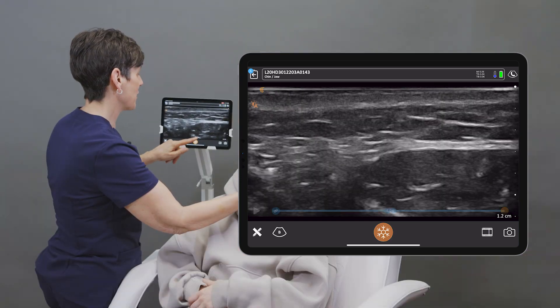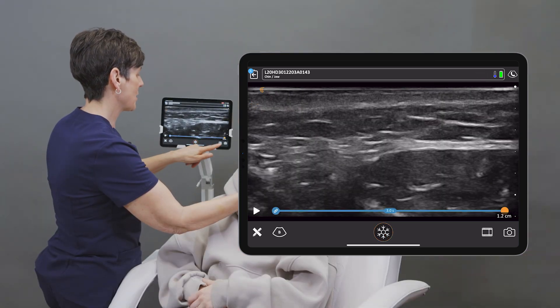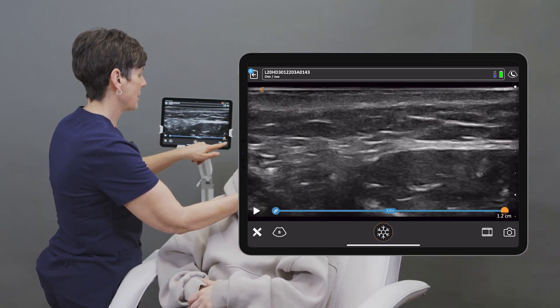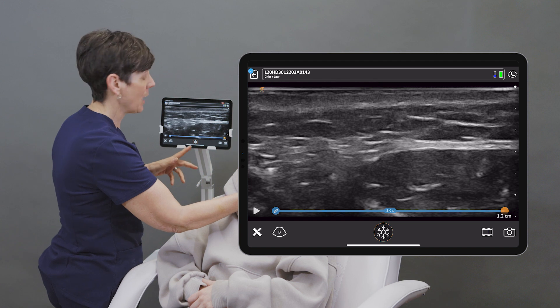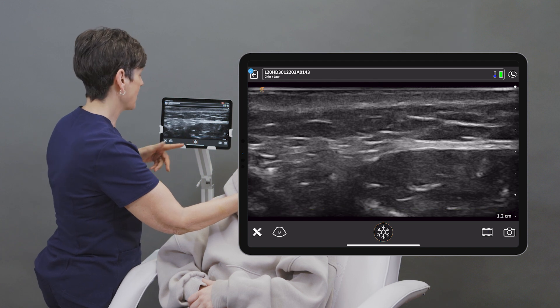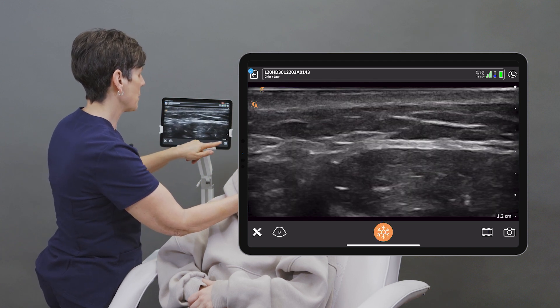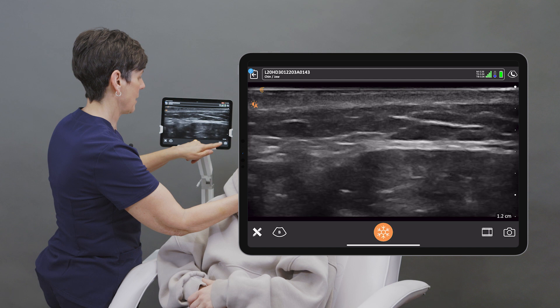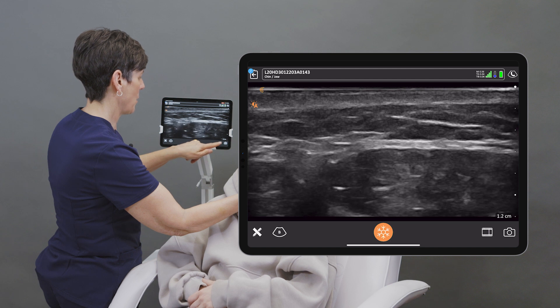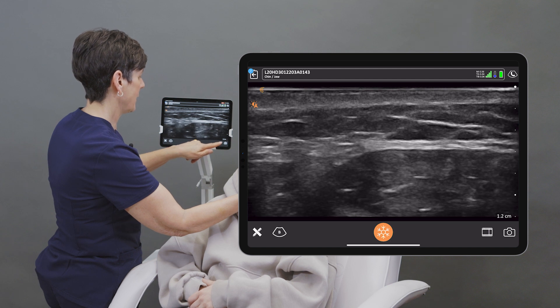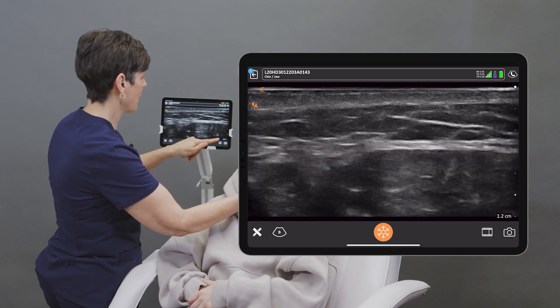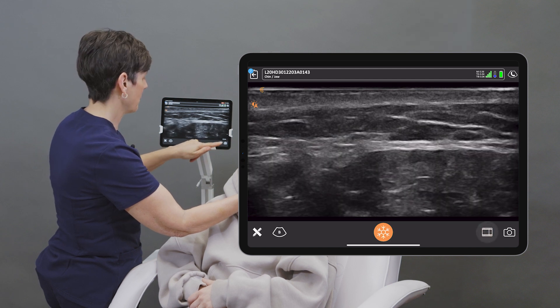I can freeze the image, tap on the camera icon to store an image. You'll also see a little film strip icon at the bottom. That allows me to save a video clip.